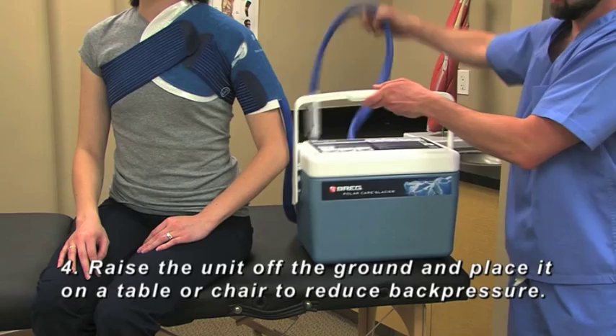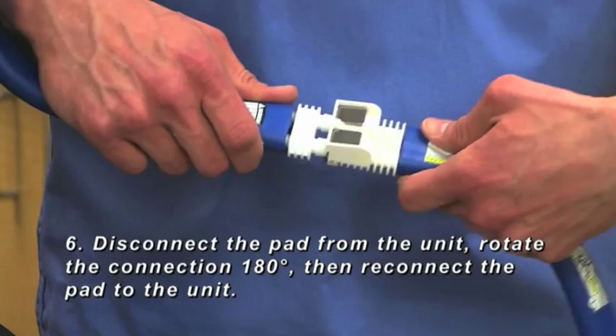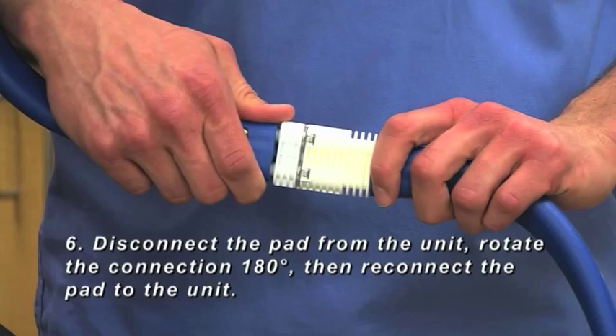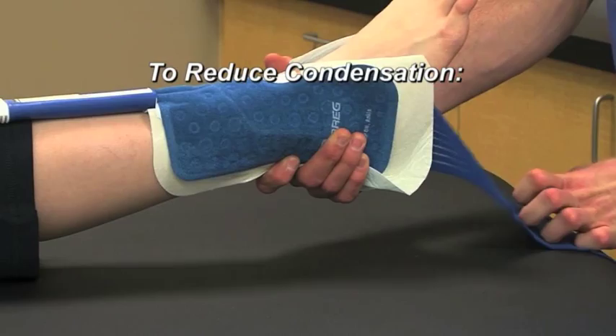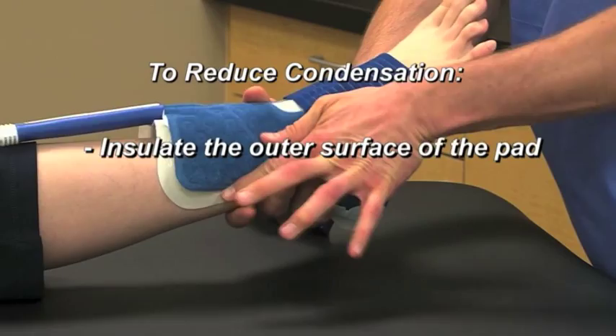Five: decrease the tension of any bandages or straps securing the pad. Six: disconnect the pad from the unit, rotate the connection 180 degrees, then reconnect the pad to the unit. If excess condensation appears on the surface of the pad, wrap the outer surface with an ACE bandage or similar material to prevent warm, humid air from coming into contact with the pad. Also, remove any warming blanket that traps warm, humid air above the surface of the pad.